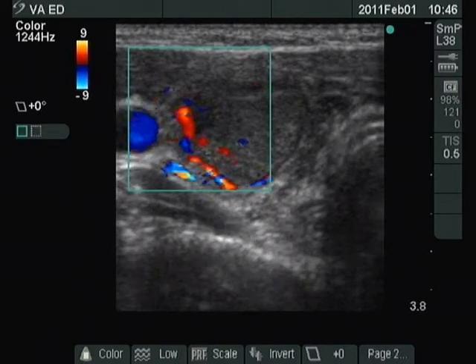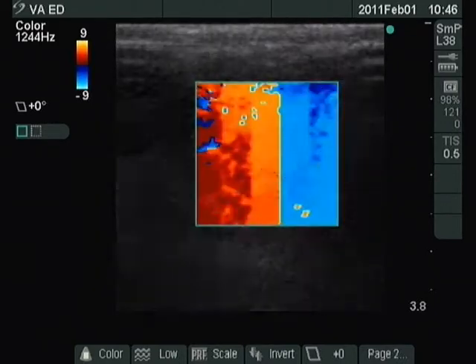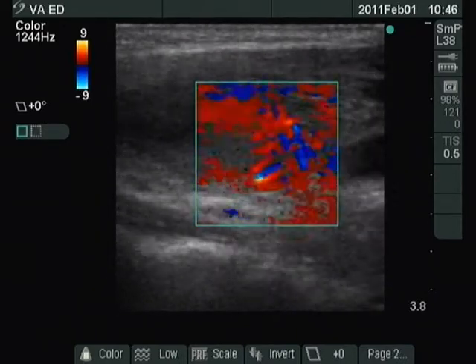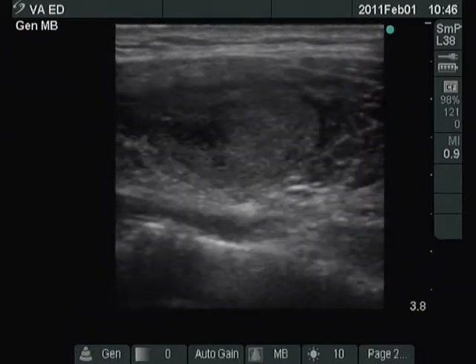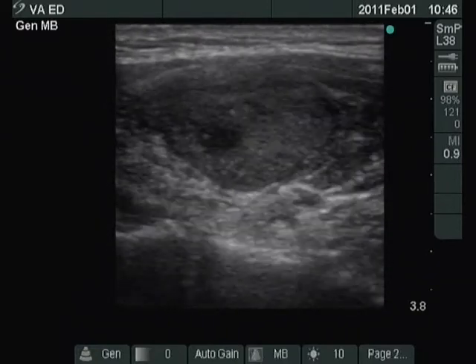Type 2 vascular pattern — this means that the nodule displays paranodular blood flow. Note the spider web-like fibrosis outside the nodule.